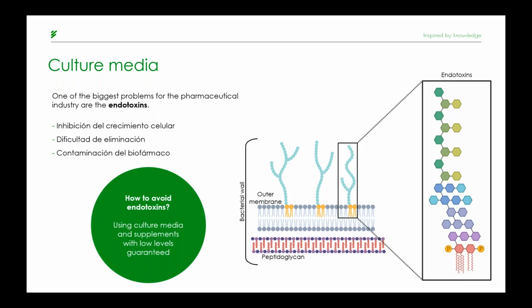One of the biggest problems with the culture media and with the supplements that the pharmaceutical industry has to face are the endotoxins. The endotoxins are lipopolysaccharides from the gram-negative bacteria membrane, the bacteria wall, and they have a high pyrogenic capacity and suppose a great danger in the synthesis of biopharmaceuticals.